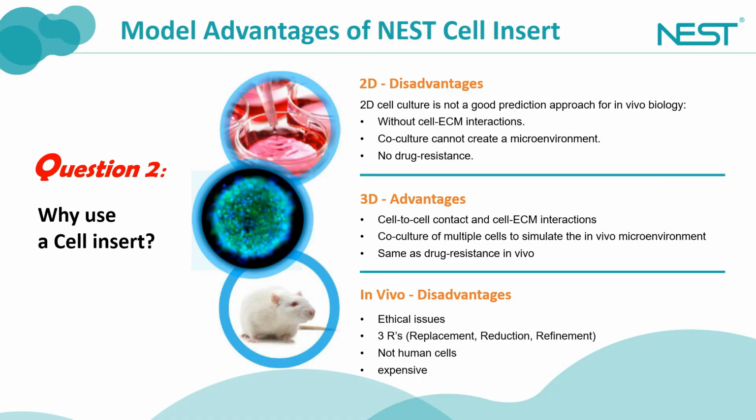Its disadvantages include that it cannot simulate the in vivo growing environment and a lack of interactions with the extracellular matrix during cell growth. If the cells inoculated in the upper chamber are polar ones, like epithelial cells or endothelial cells, then their growth in the upper chamber will have polar differentiations, showing polarity functions. This is different from the general 2D culture.